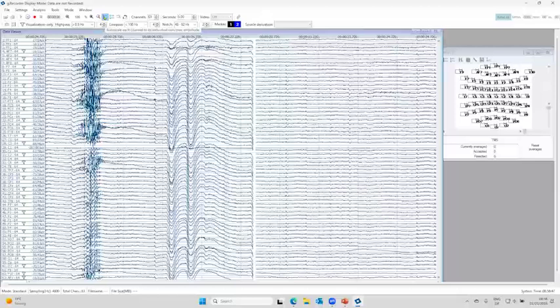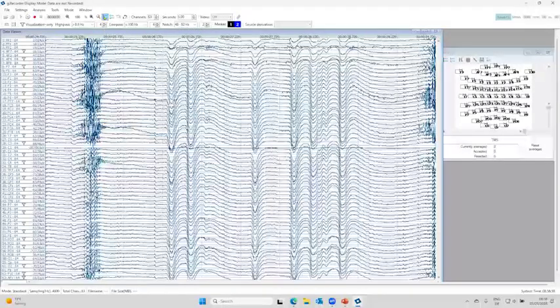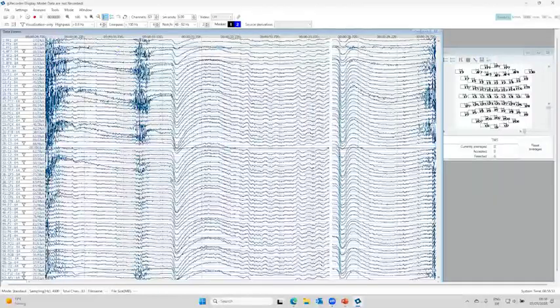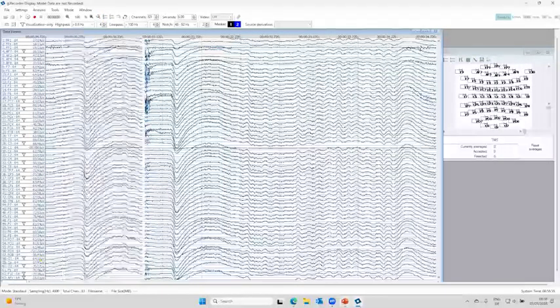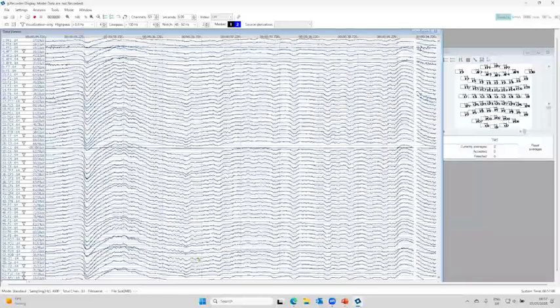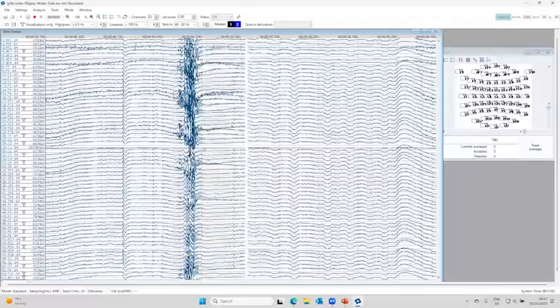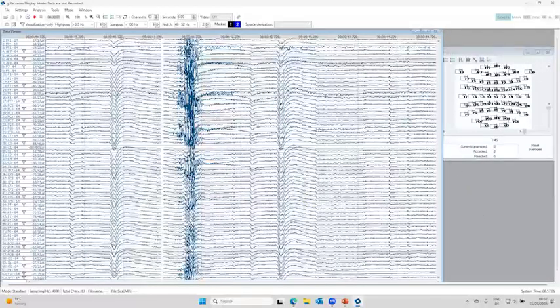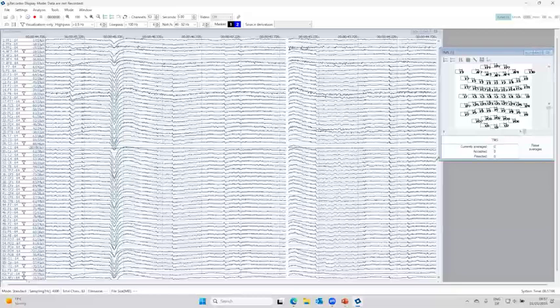Okay, so if you blink, yes, because we have the frontal reference, we have blinks everywhere. If you close your eyes, you're looking for some alpha on the back. There was something there, yes, thank you. And if you clench your teeth, we should see the EMG artifact on the EEG, okay? And we can start the acquisition.